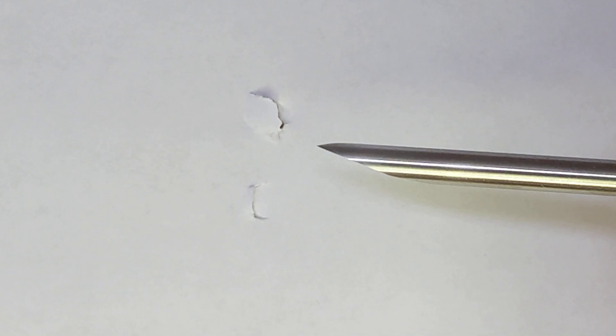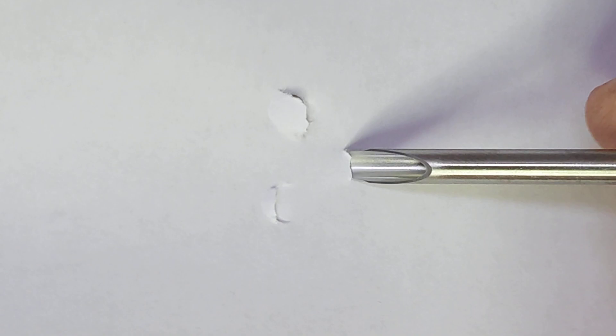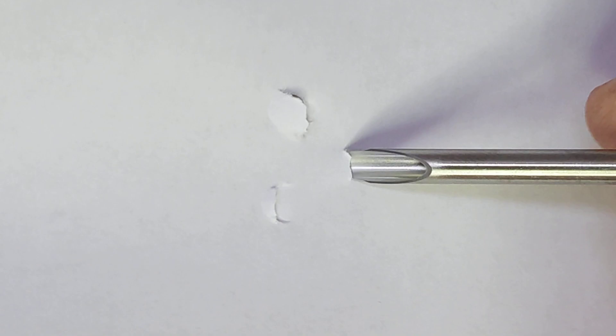If you want to try a modified approach, you can start with bevel up. You get to the point where the skin begins to collect. You can see it collecting there now with the paper and that's what happens - it folds under.